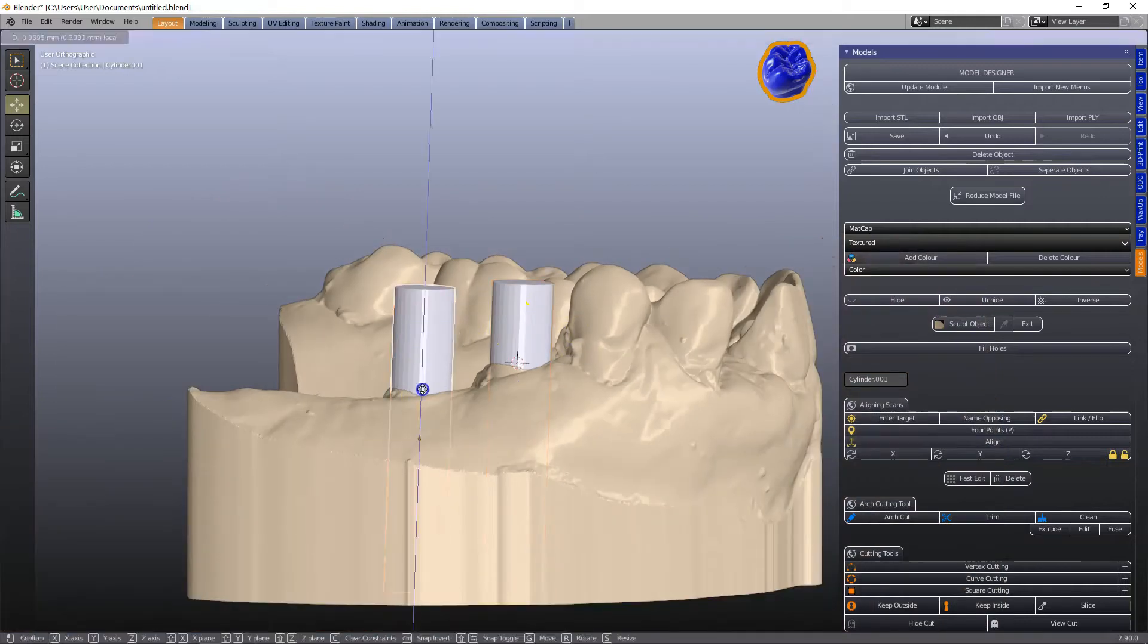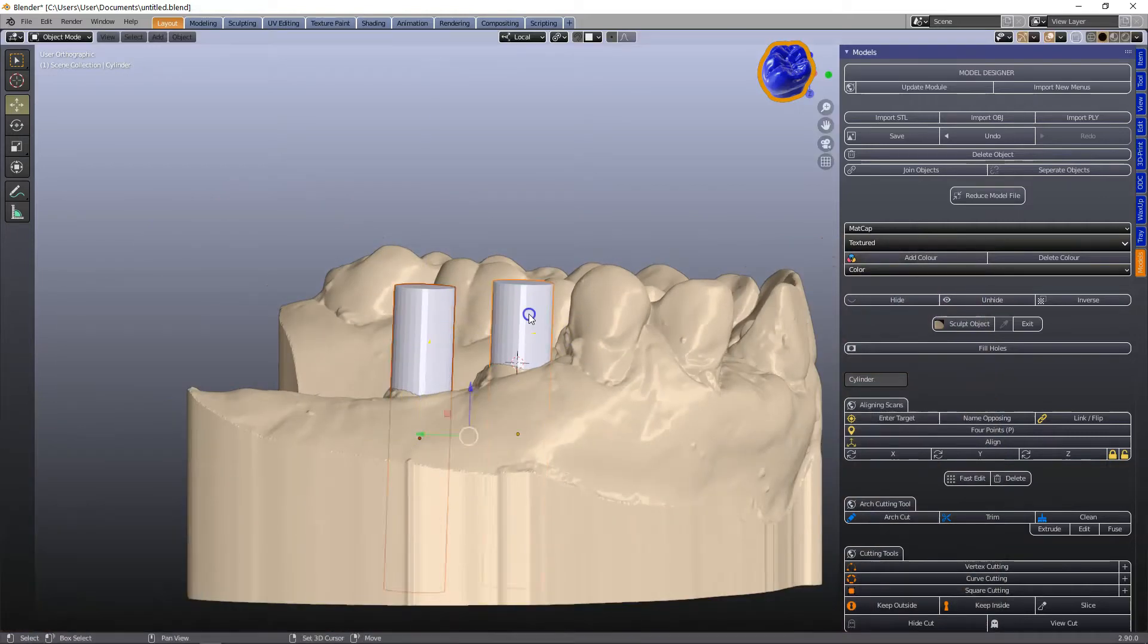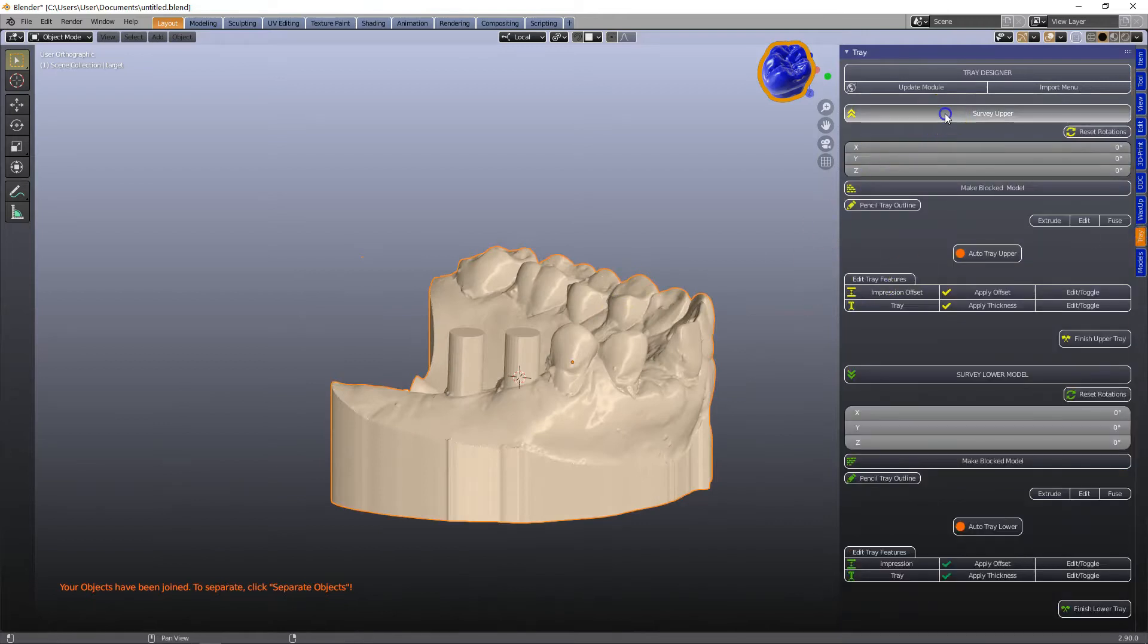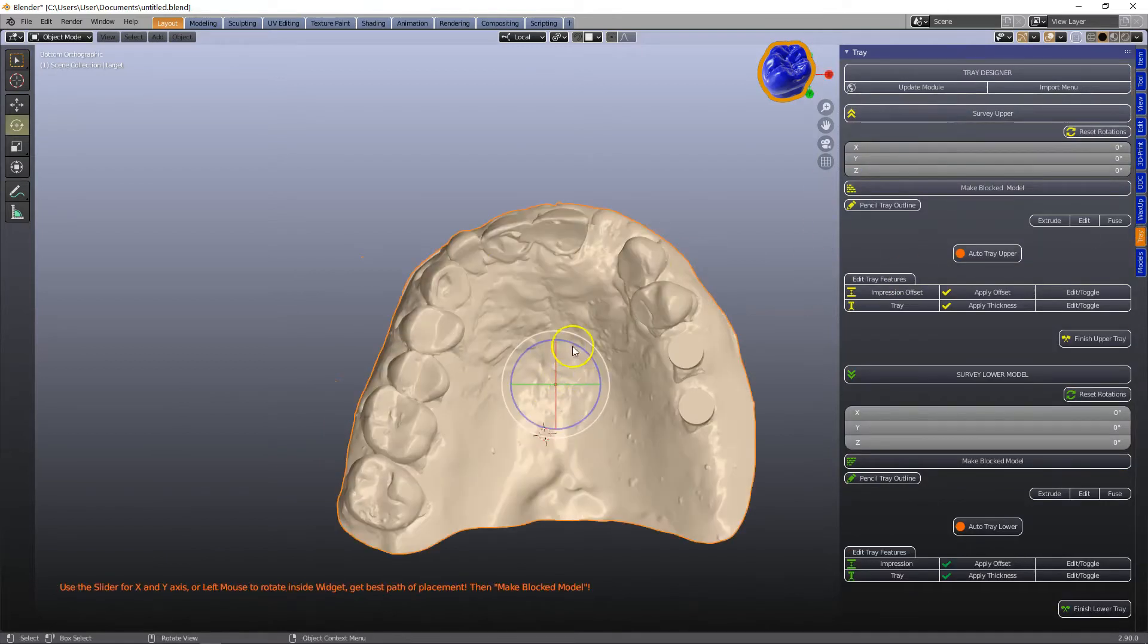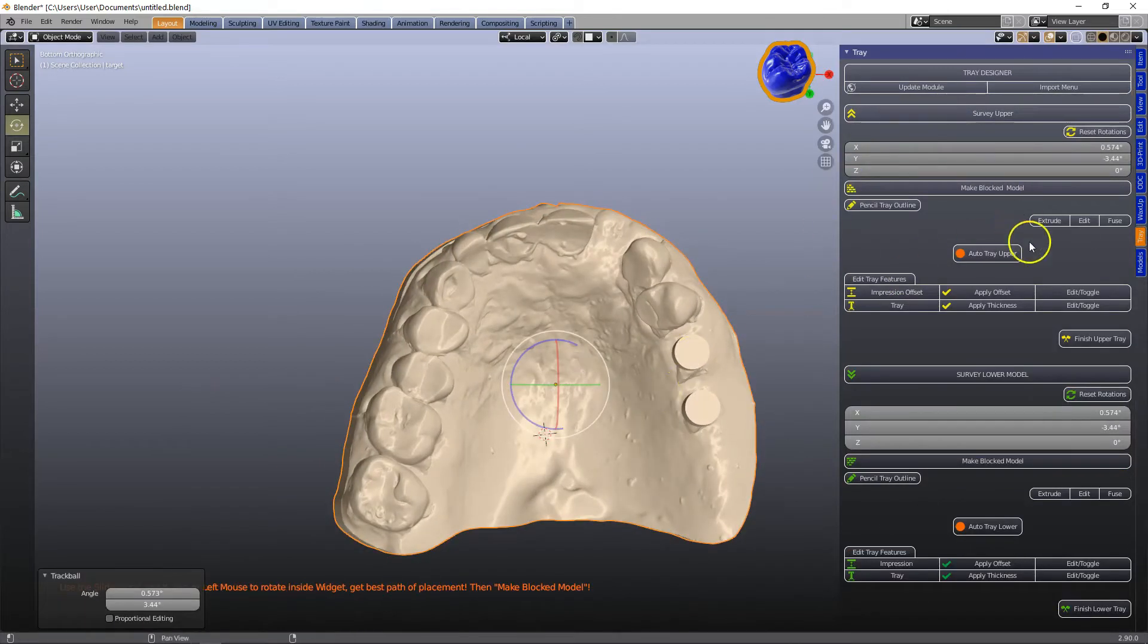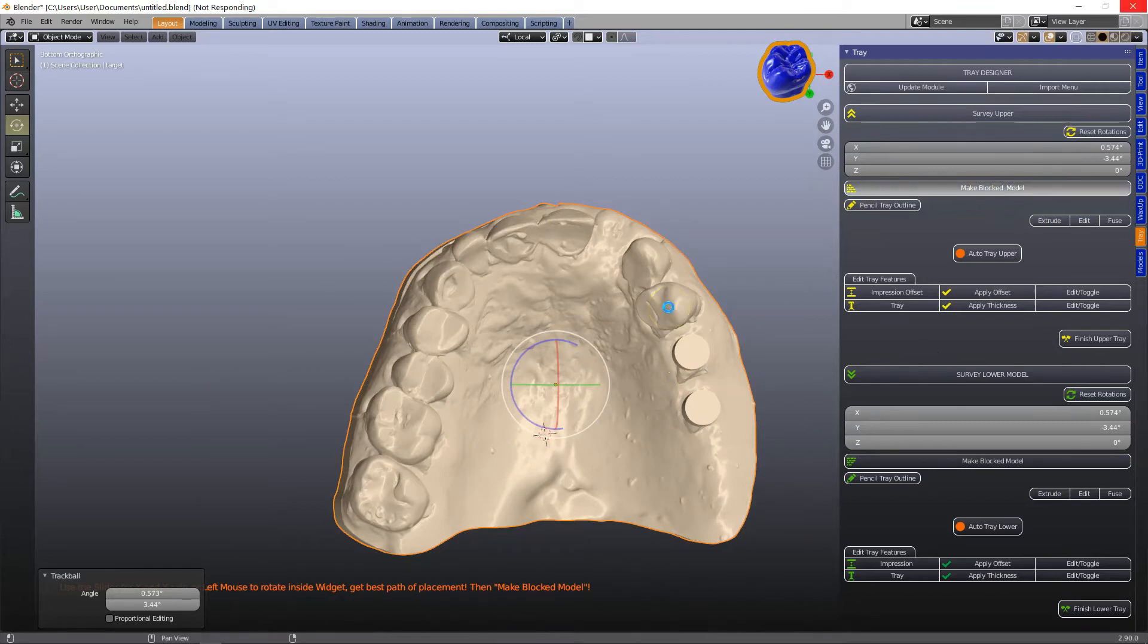Then we're going to join these up with the model being the last to join and then in the tray module we're going to survey it and then make a blocked model.